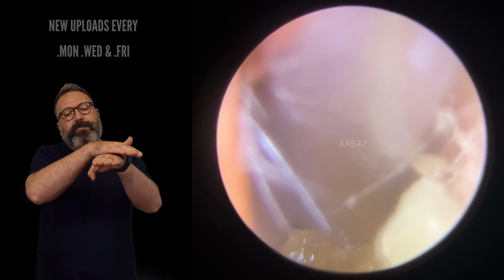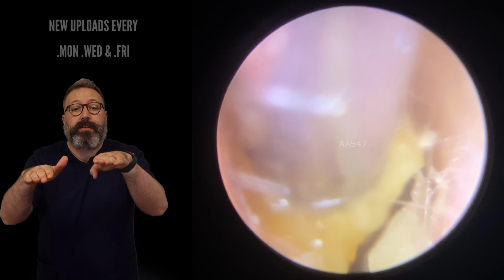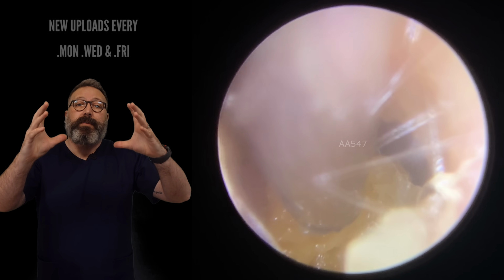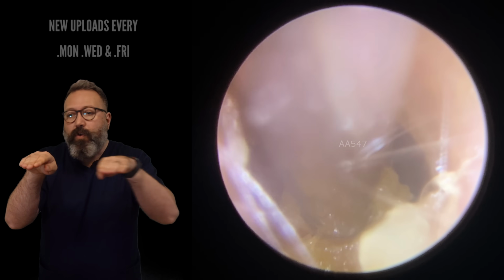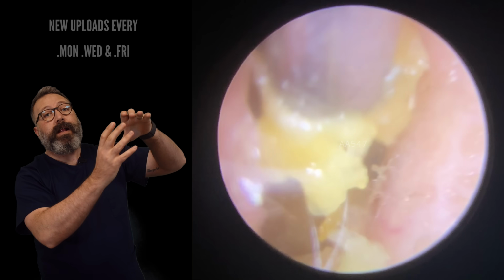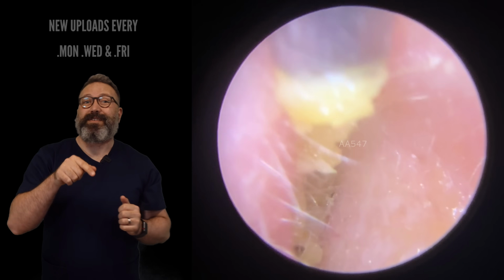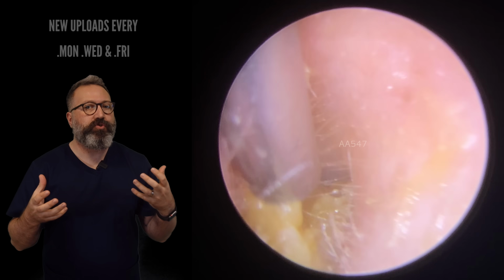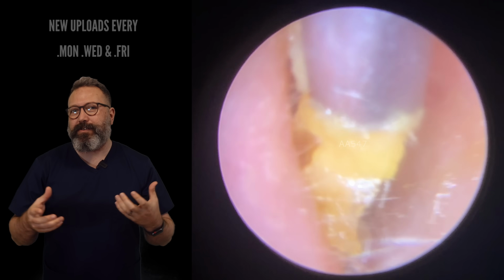Now, as the skin traverses the isthmus, because it goes over the top from one portion to the next, sometimes the top layer can come away, and that's what's happened here. So this patient, that top layer's come away and it's all started to collapse down, but don't think of it as like a flat piece of road or ruler or something like that. Think of it as a cylinder. So the whole thing's traveling down the cylinder and it goes over that bump, and then the whole cylinder kind of collapses down on itself like that, and that's what's happened here. So it tends to form a really good acoustic seal, so the patient really does struggle with their hearing quite a bit.